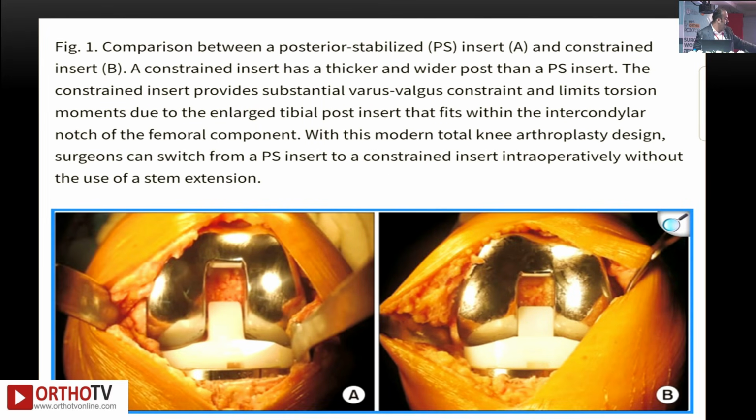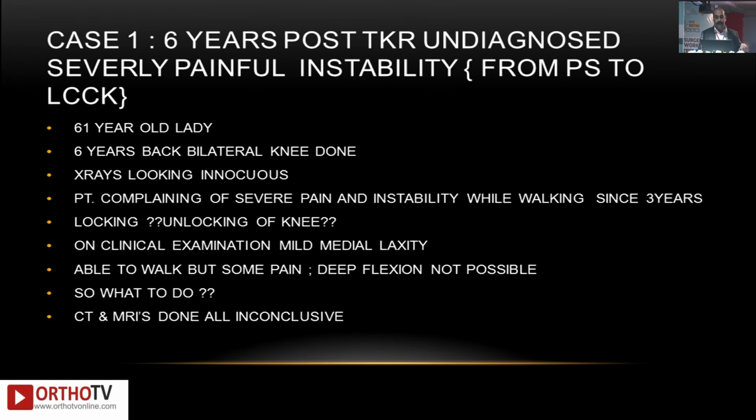That is why you should have a constrained kind of PS poly with you if you're a PS surgeon. These are the comparisons on the left side as you can see, and on the right side you can see a shorter, thicker, wider poly. So I have to move on quickly with the cases.